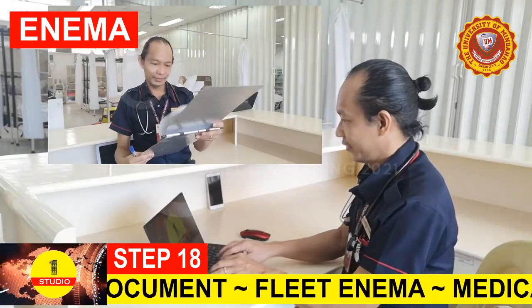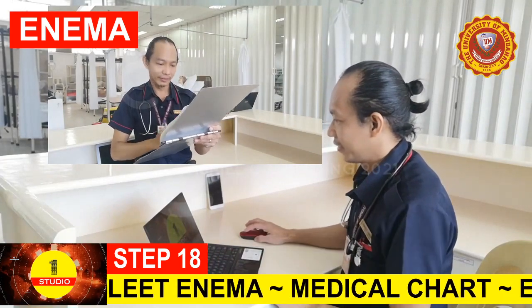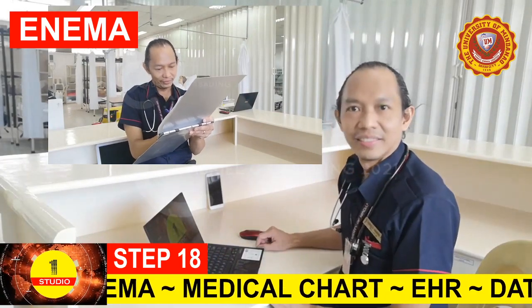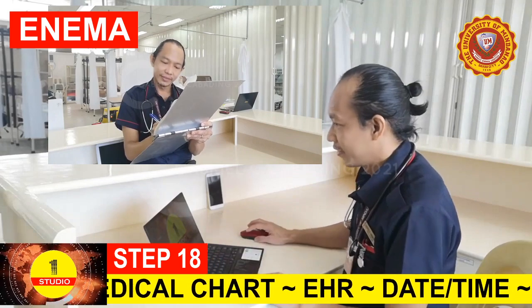Step 18. Document the performed fleet enema administration procedure into the client's chart or electronic health record.